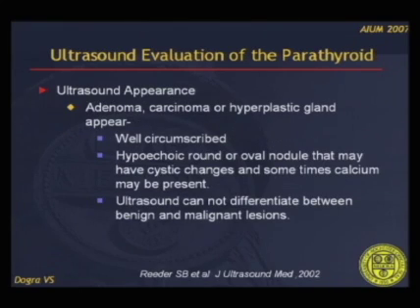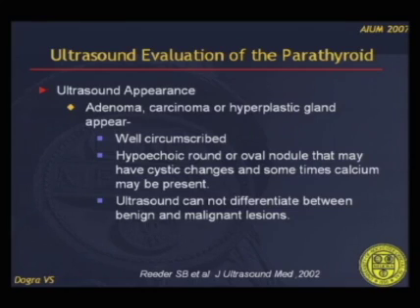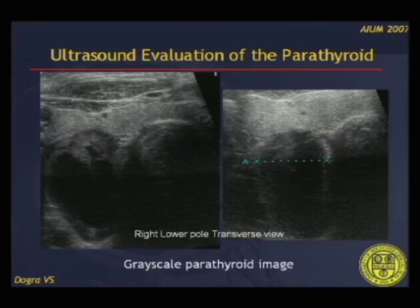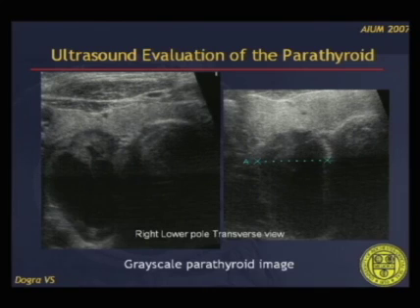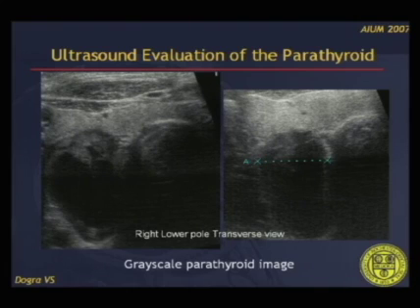The ultrasound appearance of parathyroid adenoma, carcinoma, or hyperplastic parathyroid gland is similar on ultrasound, and ultrasound cannot differentiate between benign and malignant lesions. This is an example in grayscale showing a right lower pole parathyroid adenoma, predominantly hypoechoic in appearance.